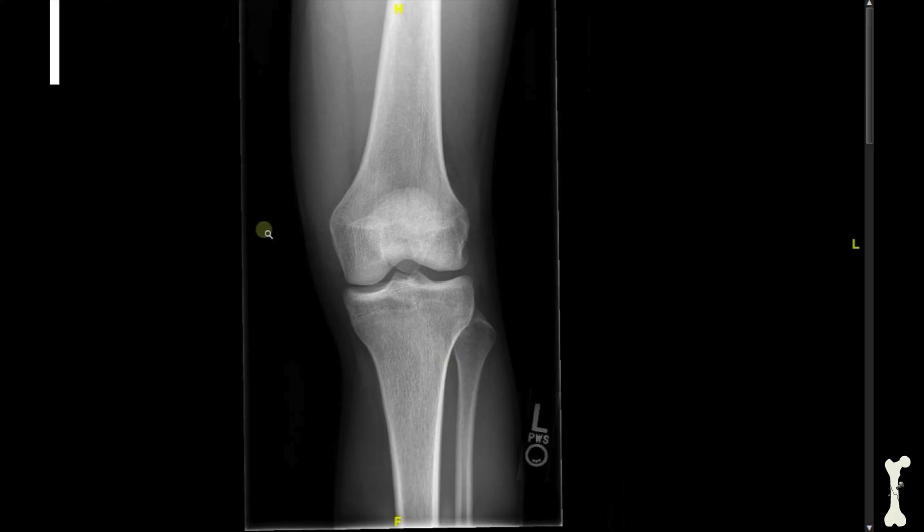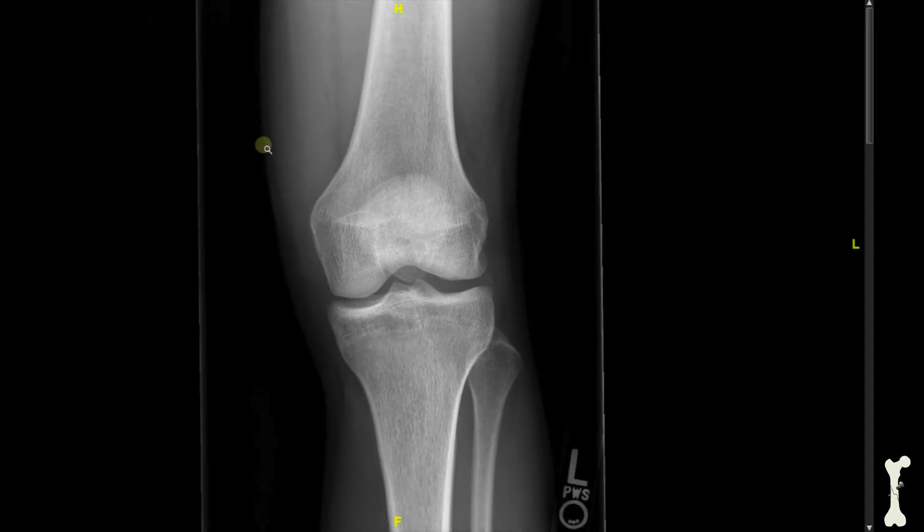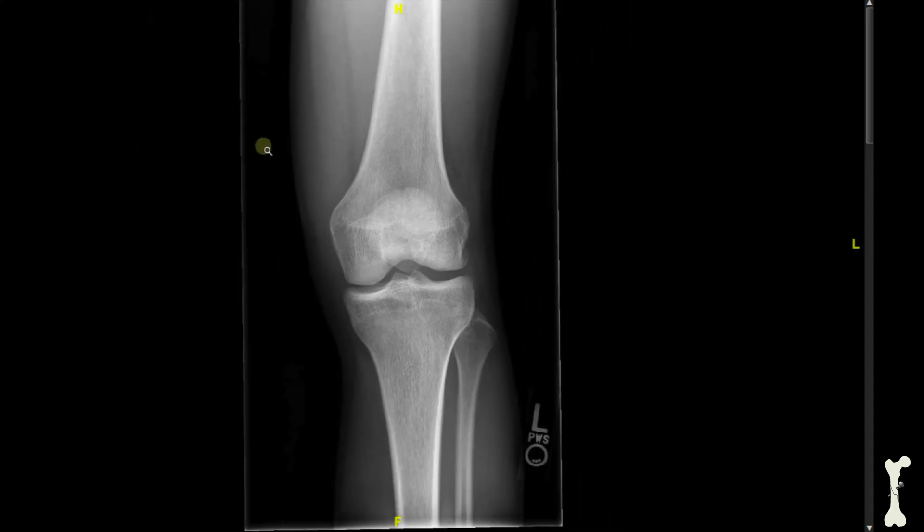Zooming in for a closer look, you can see where the thigh bone meets the shin bone on both the medial and lateral sides, and you can see that there's space right here. This space is made up of cartilage, and cartilage does not show up on an x-ray. So when you see space between the bones, that's a good thing, because that means there's healthy cartilage in between the bones there. That's the AP view, and we'll take a look at some of the other views of the knee.